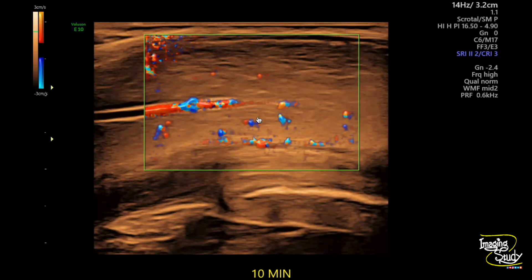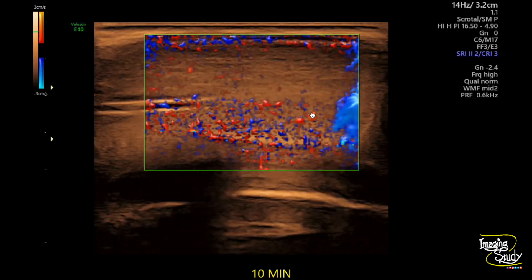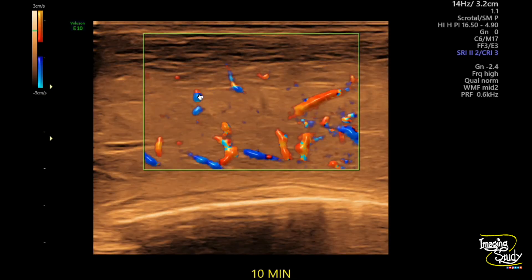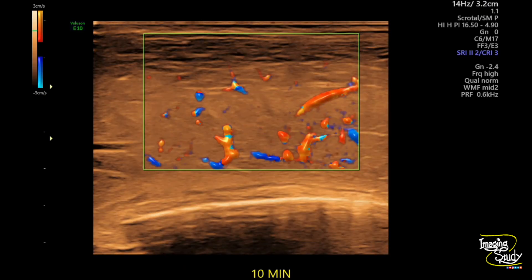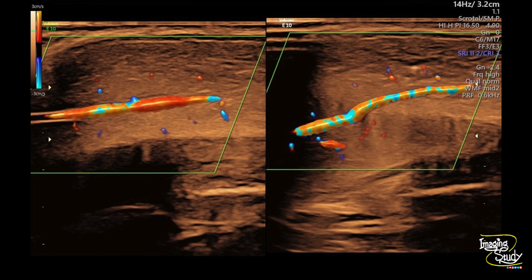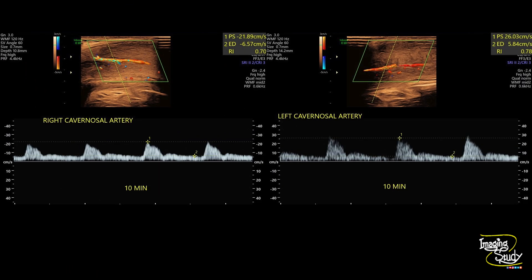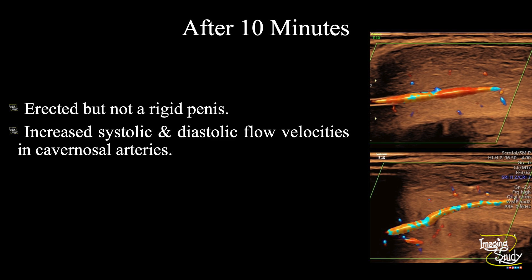At 10 minutes after injection, the vessels are very prominent. You can see the helicine arteries becoming prominent as well. This is the right cavernosal artery, and here is the left cavernosal artery with good flow towards the sinusoids. The vessels are now around 1.7 mm in diameter, and velocities are approximately 20 to 30 cm/s with persistent diastolic flow. After 10 minutes we have an erected penis but still not rigid, with increased systolic and diastolic flow velocities in cavernosal arteries.